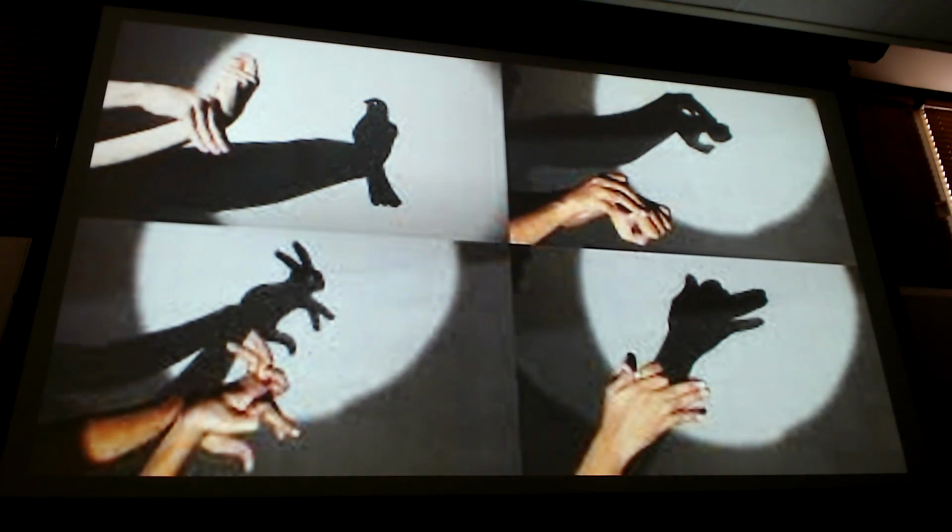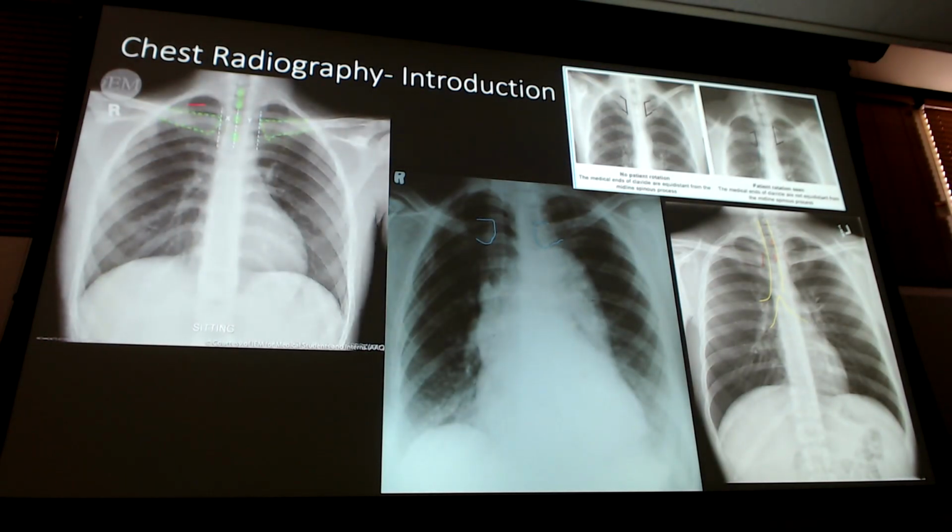Because if I go back into my normal chest x-ray, what do I have here in the way of some lung tissue? Clavicles, right? Clavicles and ribs. I can't really make out this lung tissue that well. What type of disease process, I think you covered in the pathology? Tuberculosis, right? So if I have a patient who I'm concerned with tuberculosis, do you think I'm comfortable looking for any type of cavitary lesions with these clavicles and ribs in the way? If I want to be confident that I'm not seeing anything, probably not.